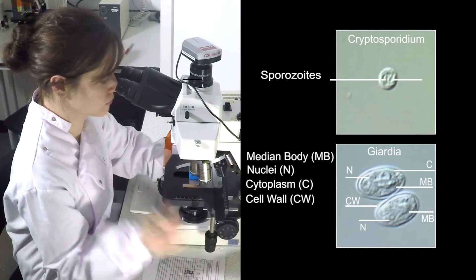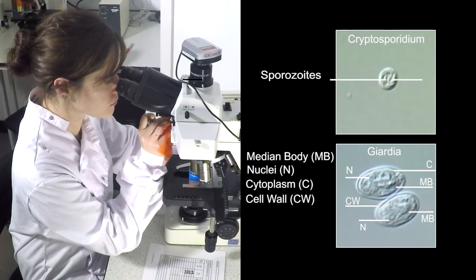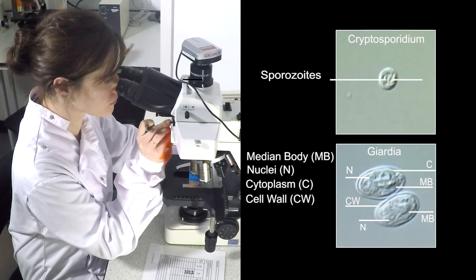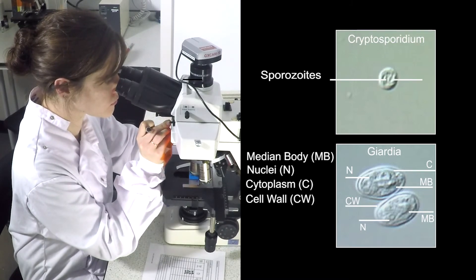For Giardia cysts, the presence of a cell wall, cytoplasm, median bodies, axonemes, and nuclei should be noted.